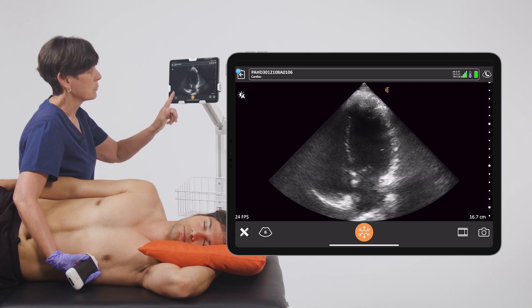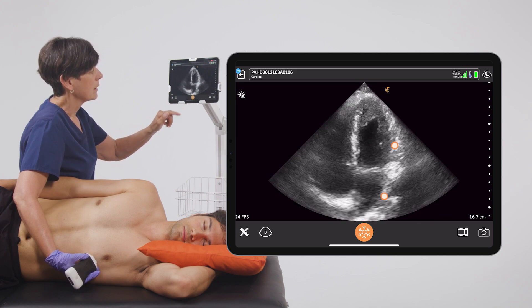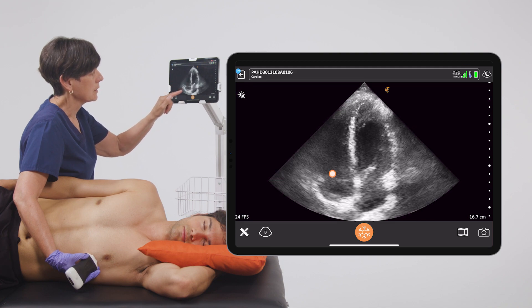From here on the right side of the screen we can see the left ventricle and atrium, and on the left side of the screen we can see the right ventricle and atrium.